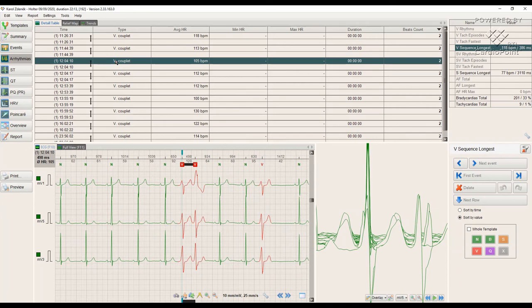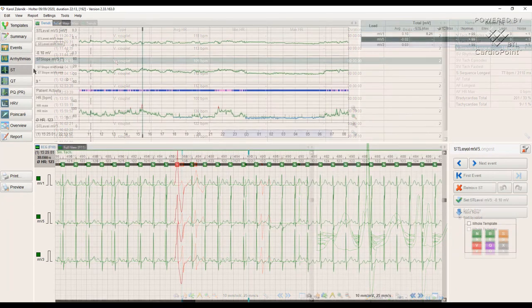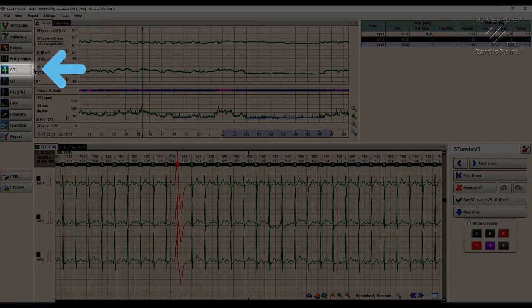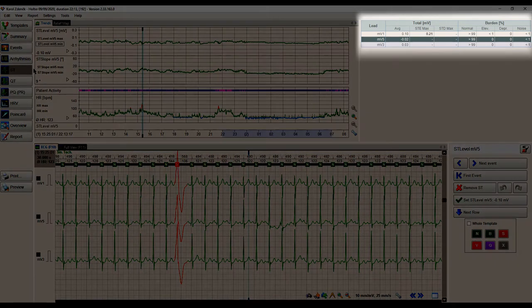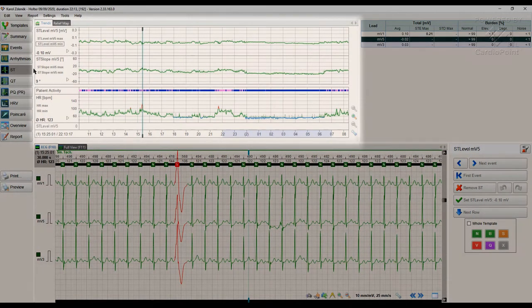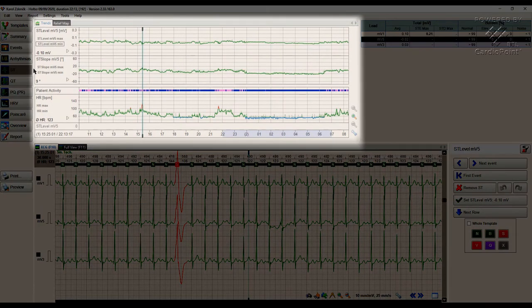The next module is ST. ST module allows us to quickly analyze the changes in ST segments which are presented in tabular form and in the form of a trend graph.